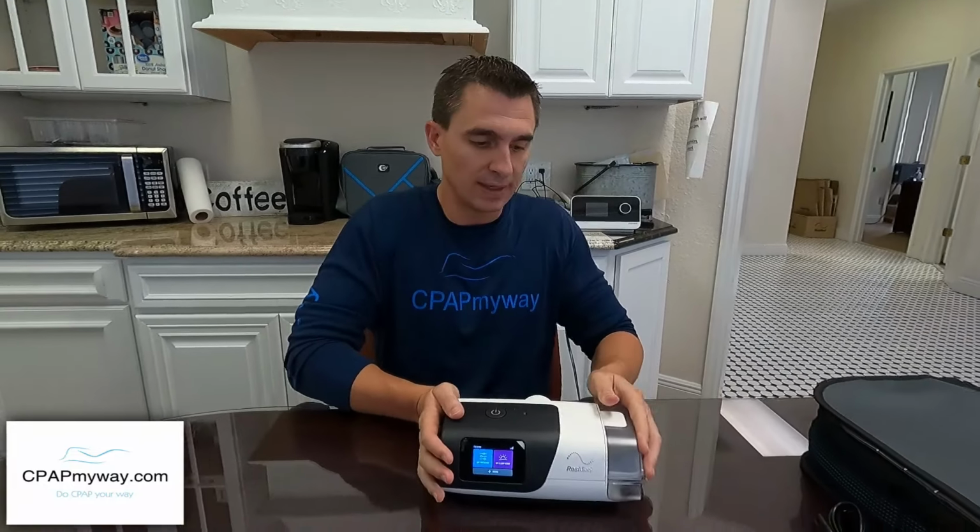And then of course your tubing, whether you're using heated tubing or standard tubing, they can be completely submerged, soap and water. Dry them really, really well before you put them back in. So really simple maintenance on it. As far as my overall take on the AirSense 11, it is definitely an upgrade.